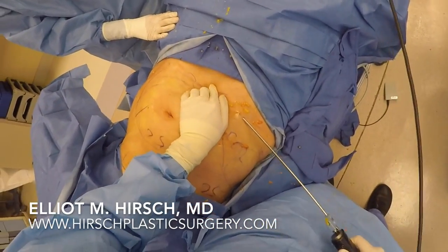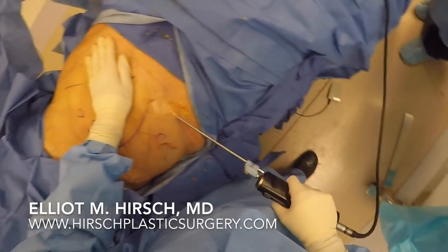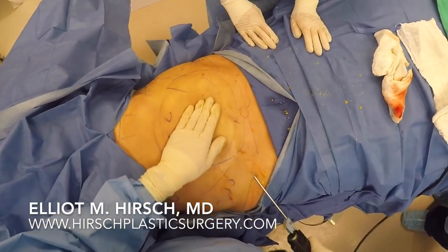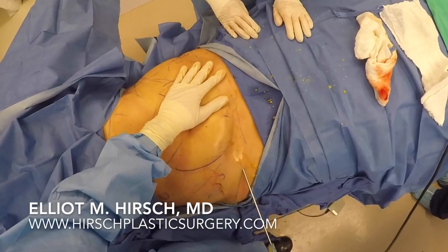During this step, the left hand is always on the patient in contact with the cannula so that the cannula is guided precisely during this dissection. We usually use a 4 or 5mm exploded tip cannula, which is passed in through the same holes as the tumescent cannula and later the Mercedes tip liposuction cannula.